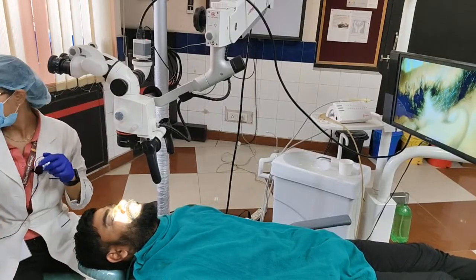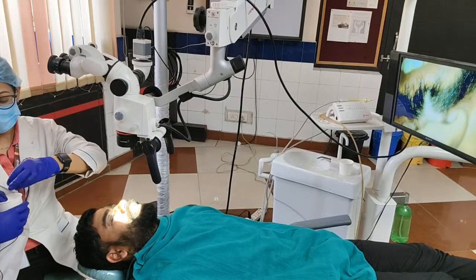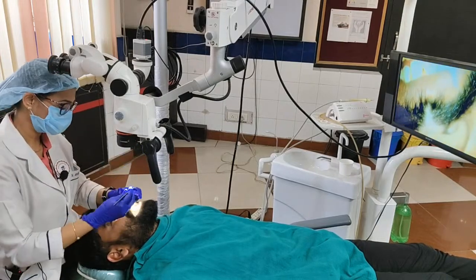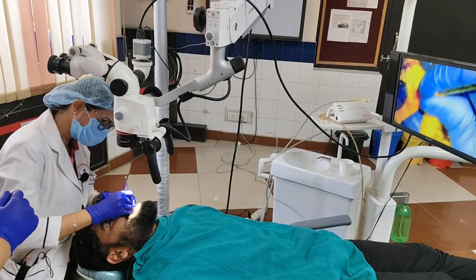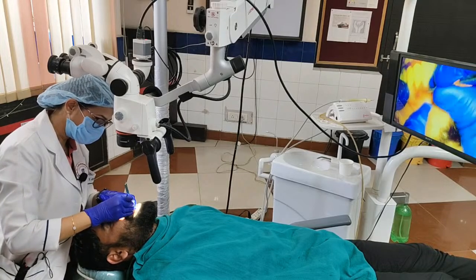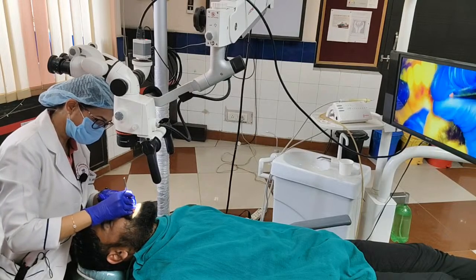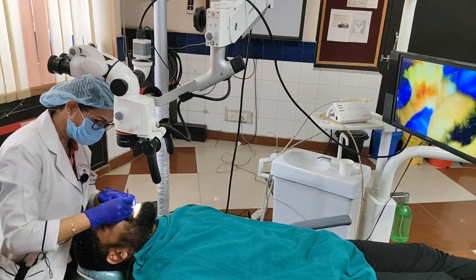Yes, ma'am. Ma'am, the patient is agreeing to wait for the afternoon slot also. So hopefully these students can have a look at the laser also. Luckily. Right, ma'am. So we'll just give him some analgesic, make him wait so that the lower can be done by laser. They can appreciate the difference and they can even have a small hands-on if possible, on the patient.